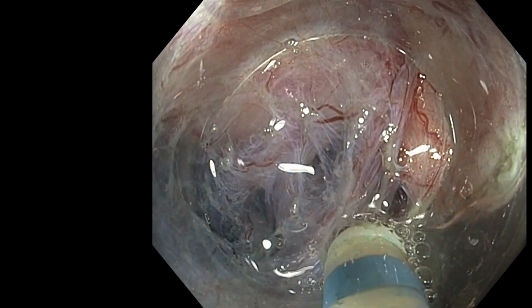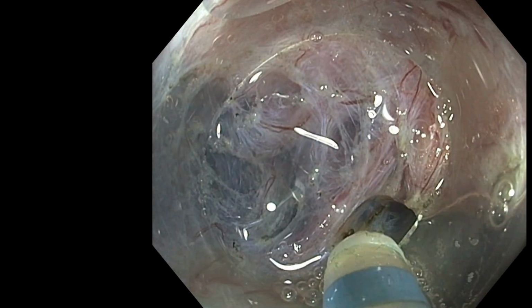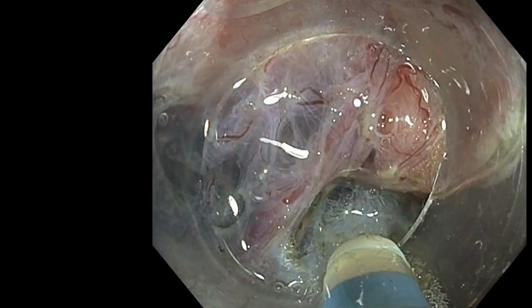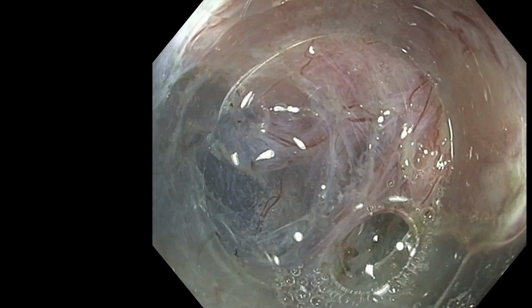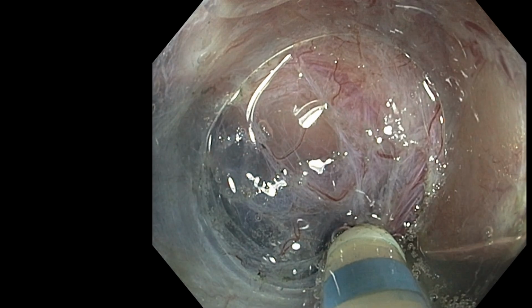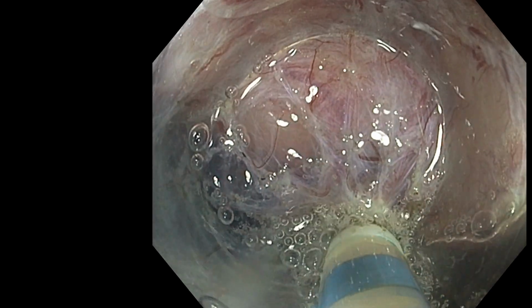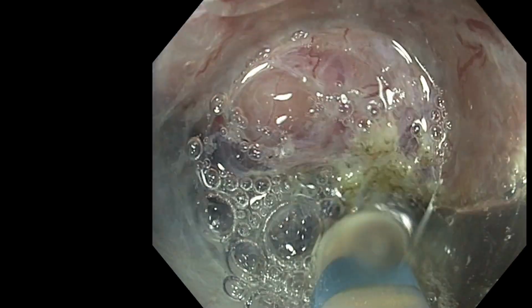You should coagulate with the lateral side of the blade, which is more effective to get a good coagulation in this relatively large trunk, and prepare the space in order to have a way to control the bleeding if it begins to bleed a lot. And even for this relatively large vessel, it's feasible to do it without using a coagrasper.